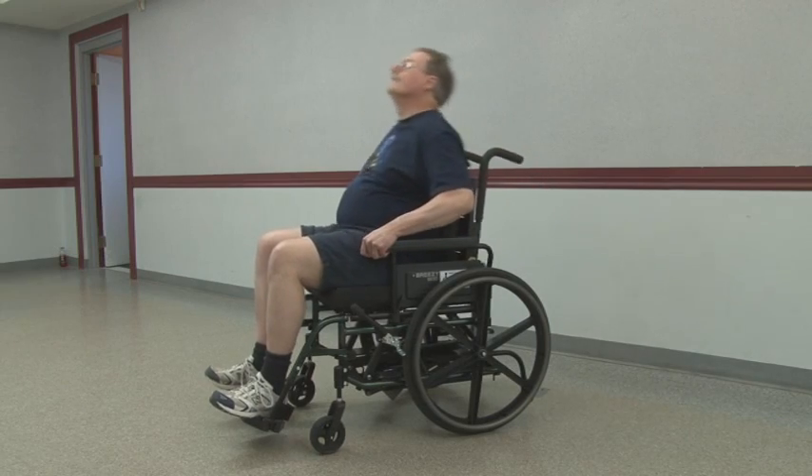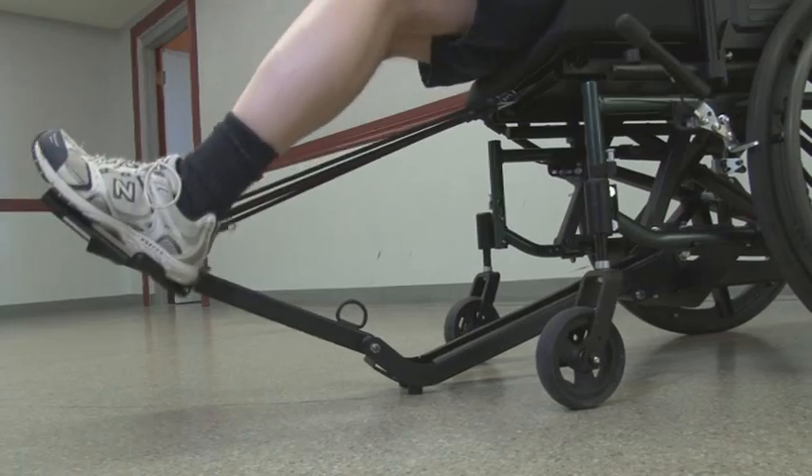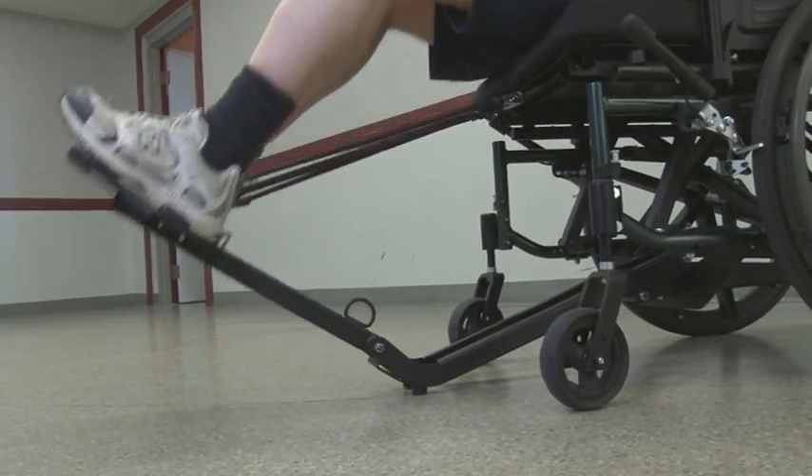The leg and trunk apparatus can be operated separately so that the user can train the lower extremities or the trunk in isolation.